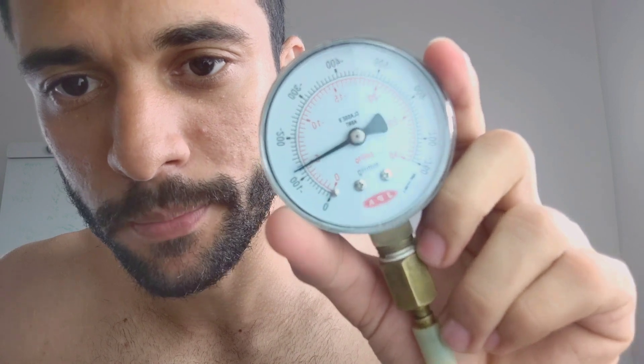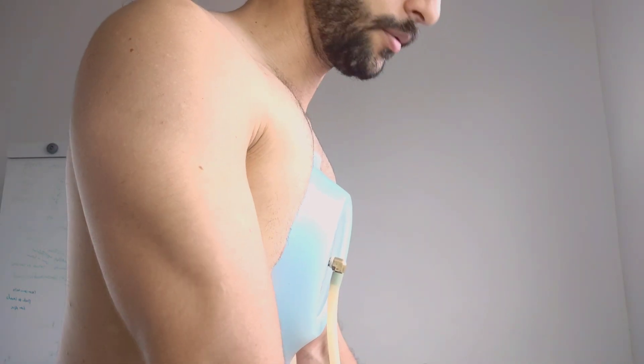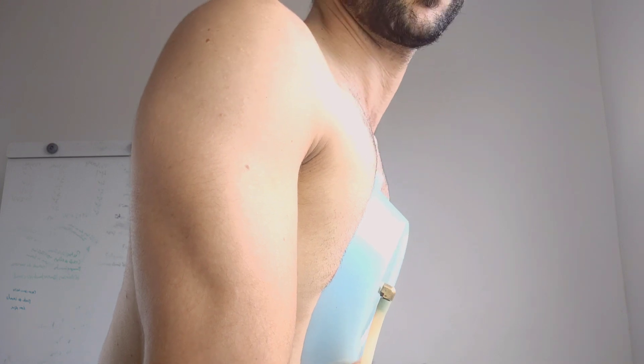My vacuum bell is at 100 mmHg of vacuum pressure right now. What you can simply do is take your air out and stretch — you're going to feel everything pulling in your back as well, and that's what you want to feel. You can do this laying down on the bed.